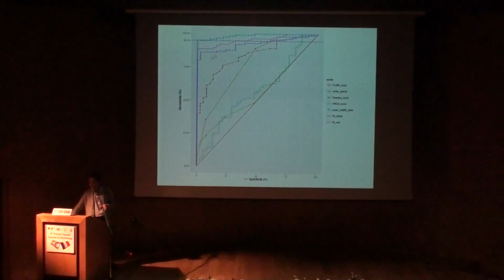If you quantify the FLAIR, you get even better information. And if you quantify a composite of the FA on the white and gray matter, this is the ROC curve. You are nearly at 100%. So it's a very simple mechanism of injury, and with that, DTI is really highly reliable. Diffusion-weighted imaging was already very good. When you add the DTI information, you are even better.